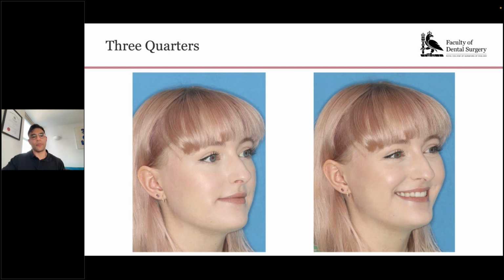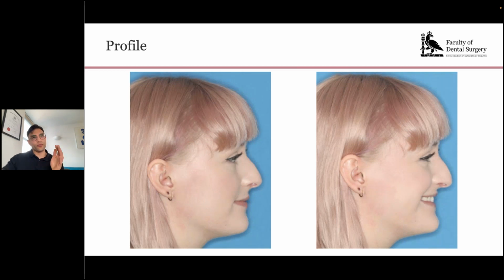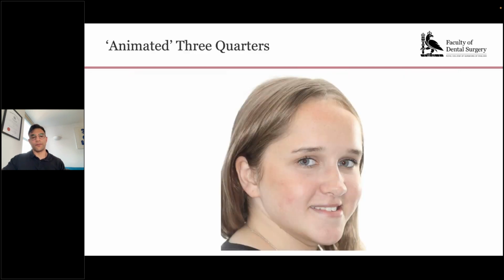And in the profile, you want the patient to be looking in natural head posture. So you want them to be looking at a point distant on the horizon. So they're holding their head the way that they ordinarily hold it in their day-to-day lives. And that gives you the truest appreciation of their skeletal pattern in the vertical and in the anteroposterior dimension.